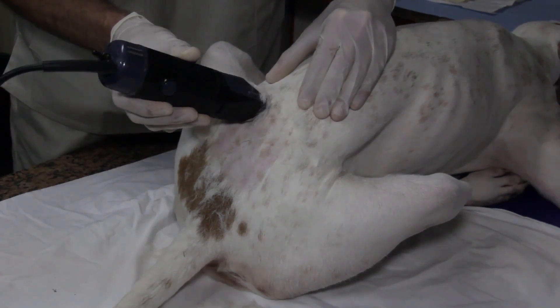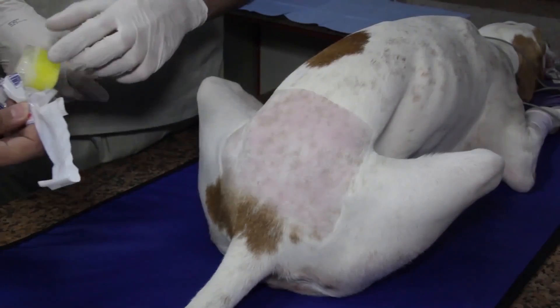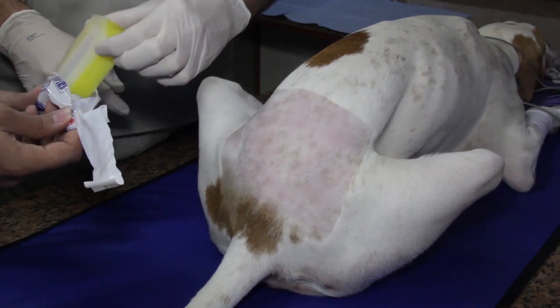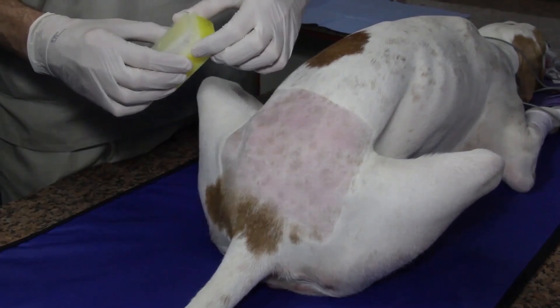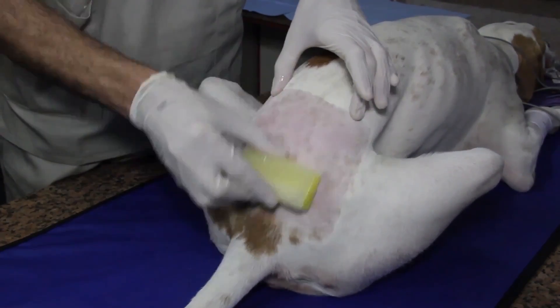This position enables the use of the hanging drop technique. However, this technique may not be evident in cats and small dogs. Next, this region is prepped in the same manner as for a surgical intervention using alcohol and a disinfectant.